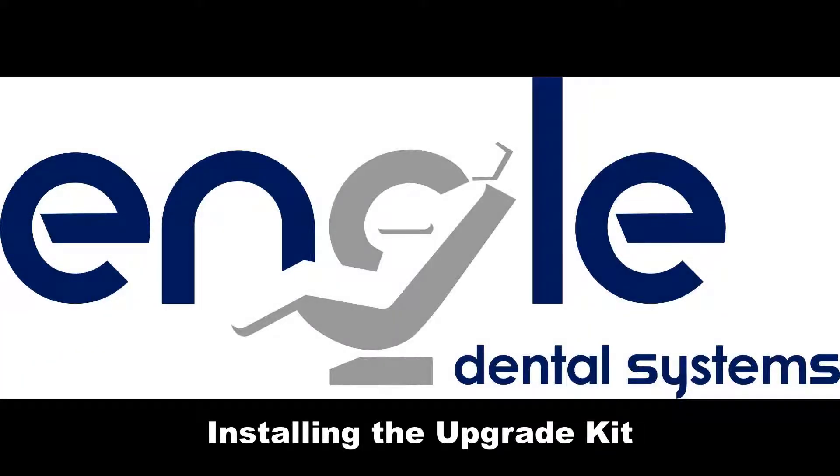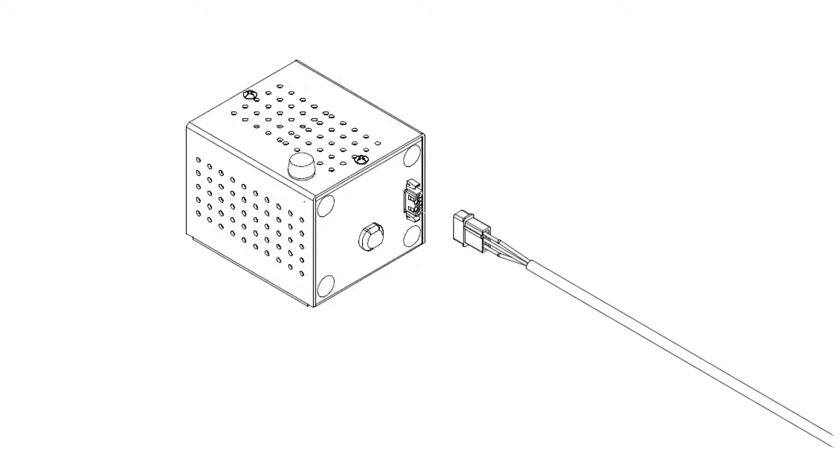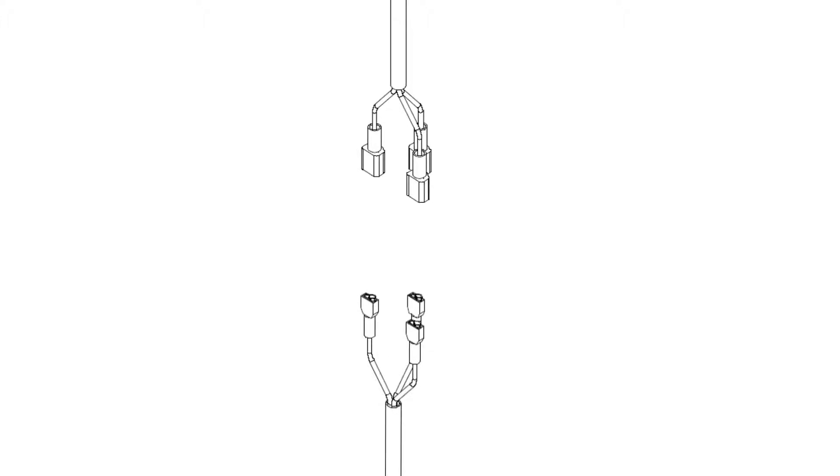Installing the Upgrade Kit: Unplug the transformer for the halogen system from its power source. Disconnect the 3-pin molex connector from the halogen light transformer. Disconnect the halogen light wiring harness.